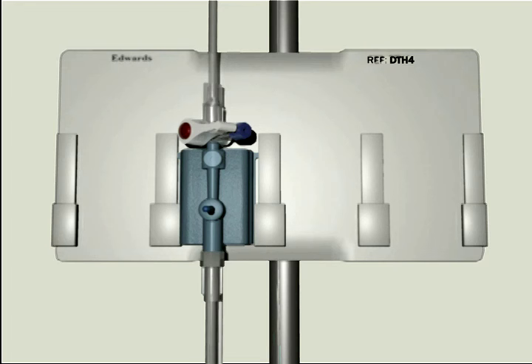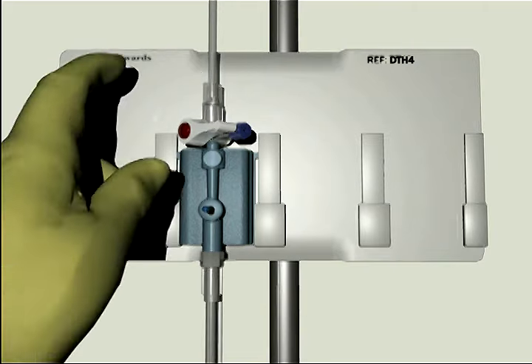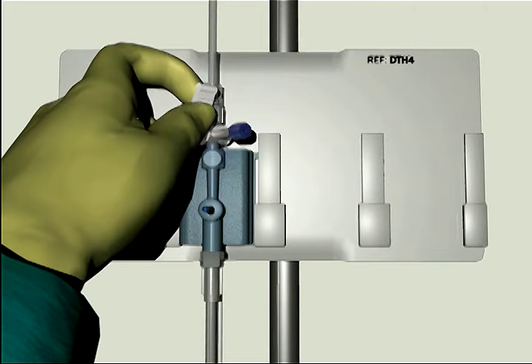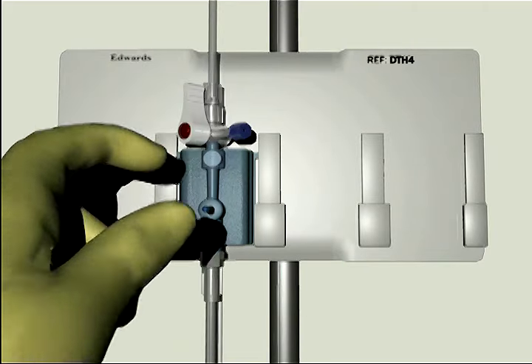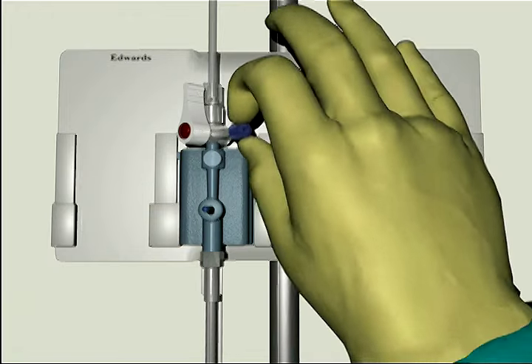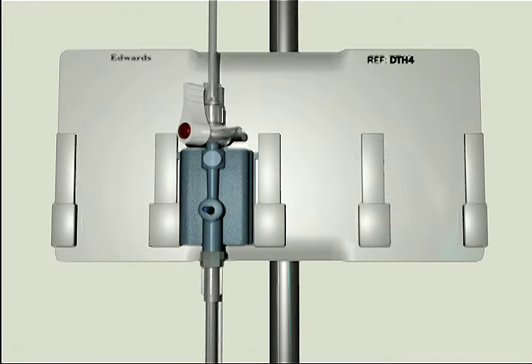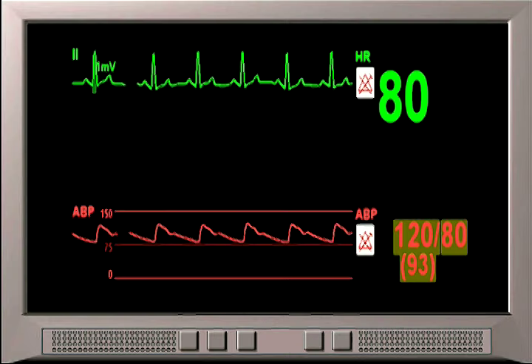The TruWave transducer must be zeroed to remove the effects of atmospheric pressure. Open the stopcock above the transducer to atmospheric air by turning the stopcock toward the patient's pressure tubing and away from the TruWave transducer. Then remove the non-vented cap. Perform this maneuver while maintaining sterility of the cap and the stopcock port.